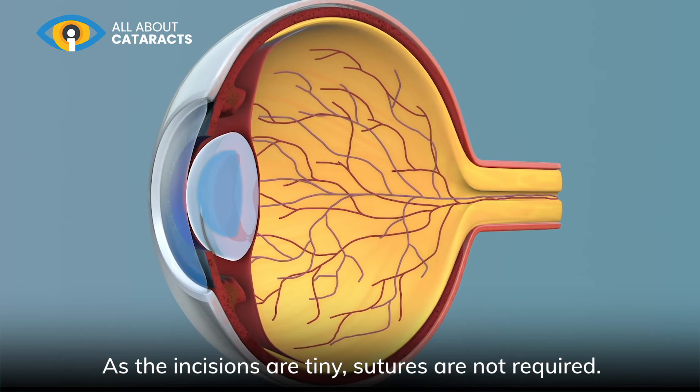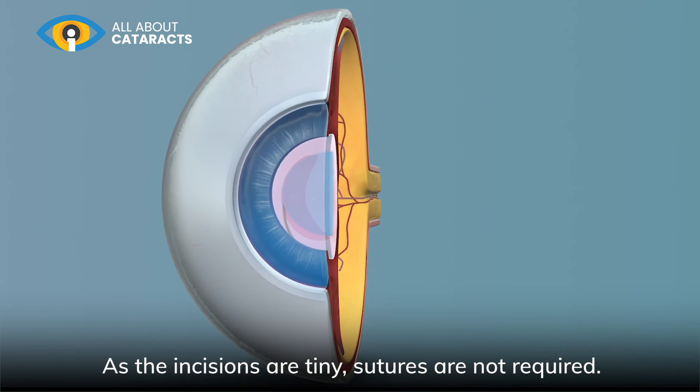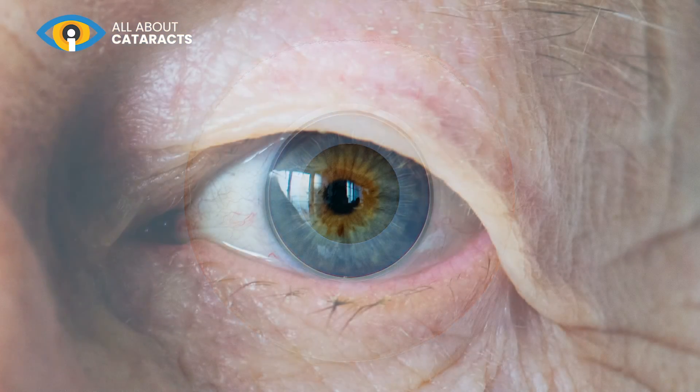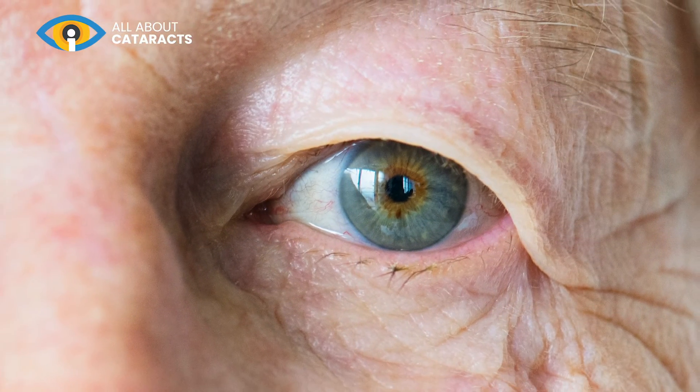As the incisions are tiny, sutures are not required. The procedure usually takes around 10 minutes, and you may notice a change in your vision soon after.